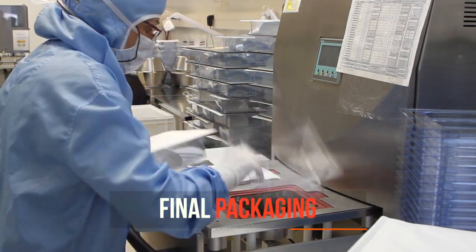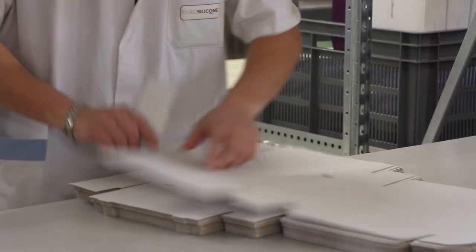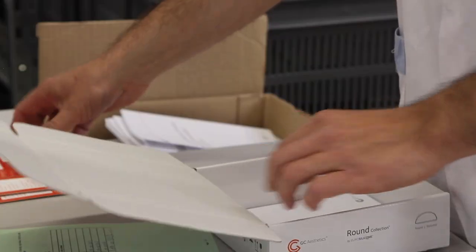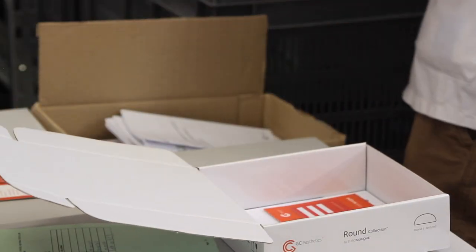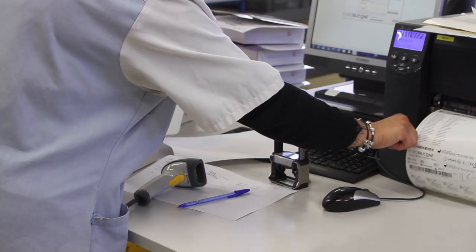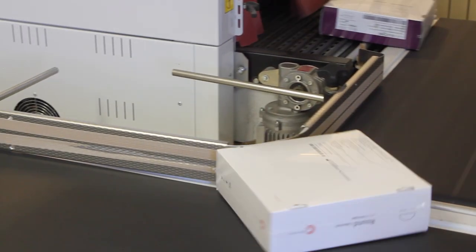So here we are doing a double packaging with blisters. That's the final step of the process. And after this step, the product is going to the sterilization process.